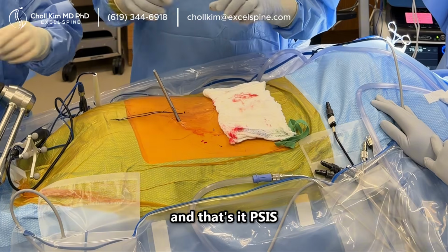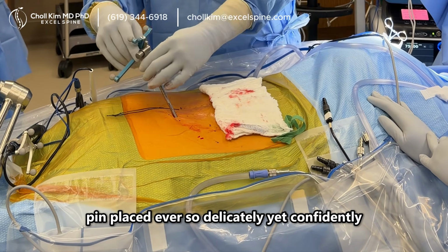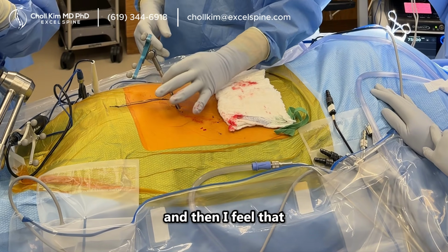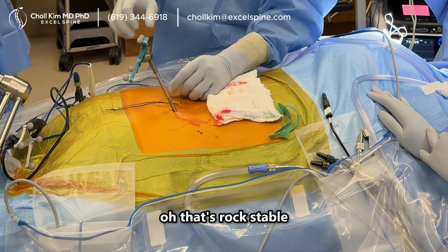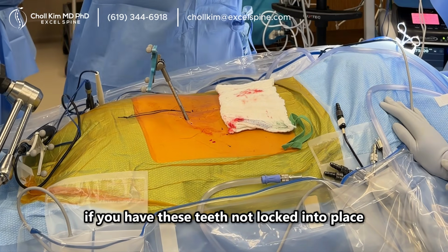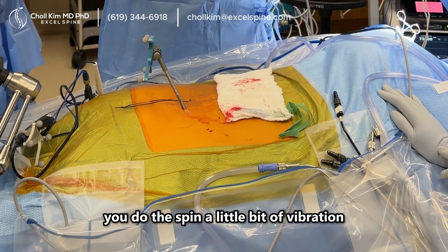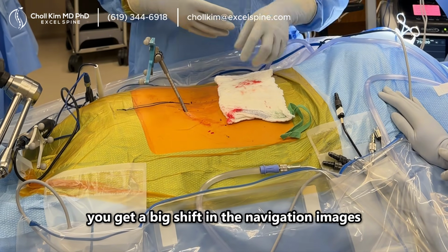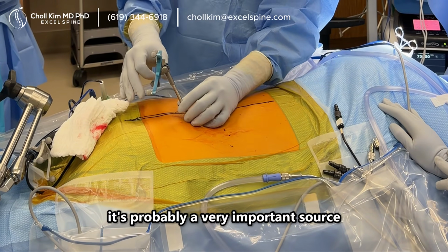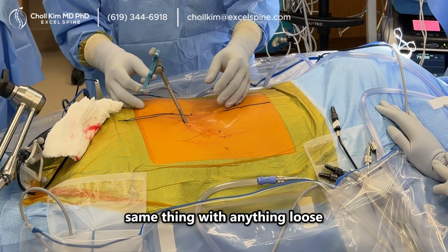And that's it. PSIS pin placed ever so delicately yet confidently. And then I feel that. Oh, that's rock stable. And double check this right here. If you have these teeth not locked into place but perched up like this, and you don't know it, you do the spin, a little bit of vibration, it clicks into place, you get a big shift in the navigation images and you may not notice. And it's probably a very important source of navigation error. Same thing with the balls, same thing with anything loose.